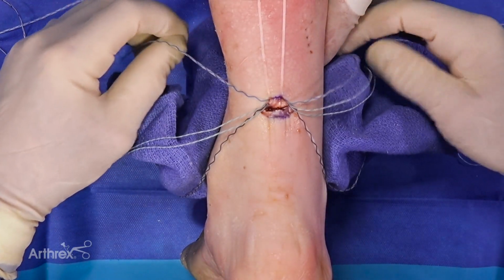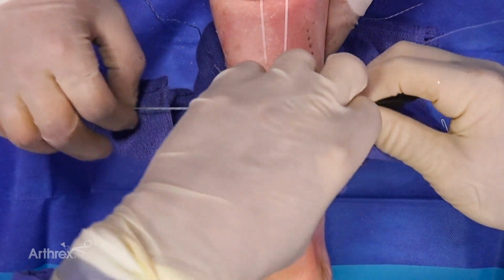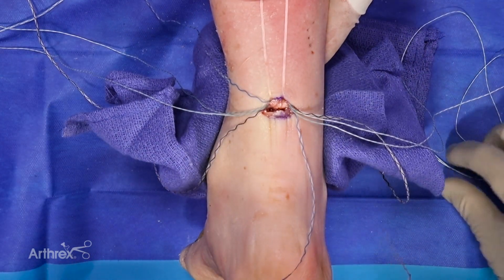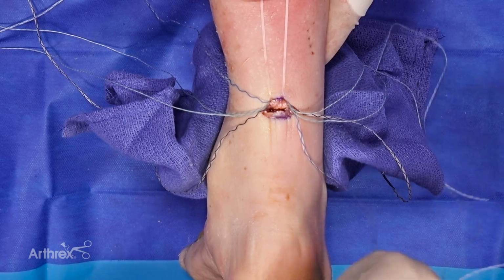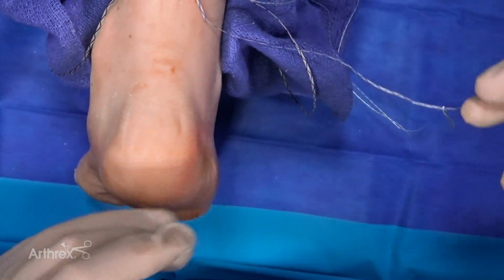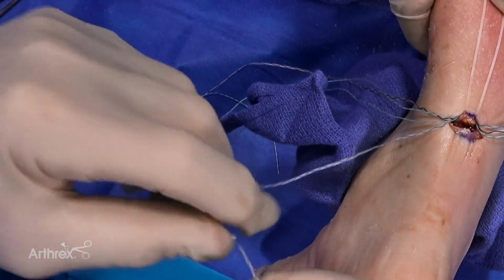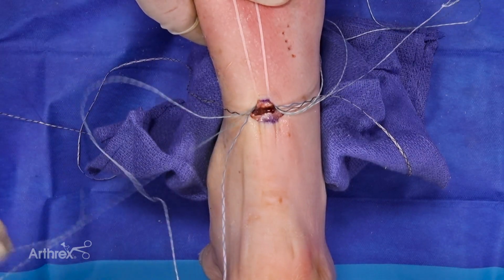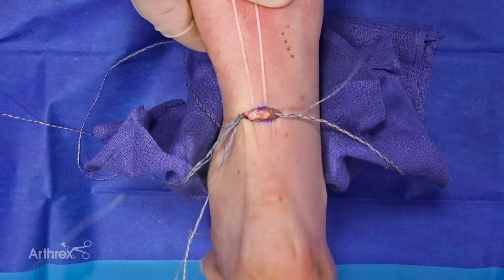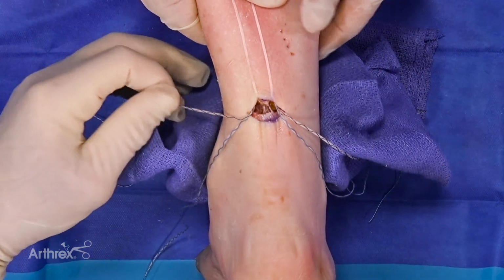Now, as I mentioned before, our blue stripe is going to become our lock suture. So what you can do, and there's many different ways to do this, but I go under the other three below it, find my loop, put that zebra through the loop of one of your loop sutures, and then your assistant can do the same on the other side. Now, as you see, I can take the other loop, the non-looped end of that other loop suture, and use that to draw the blue stripe through from one side to the other. And then we'll do the same on the other side. And again, that way I know I've kept my sutures in proper order.